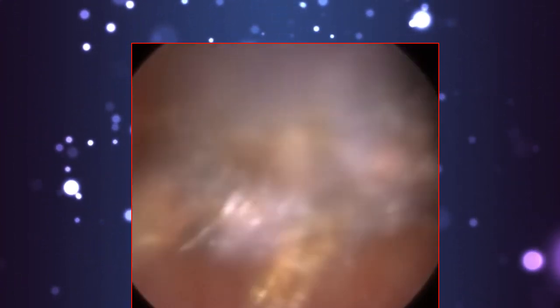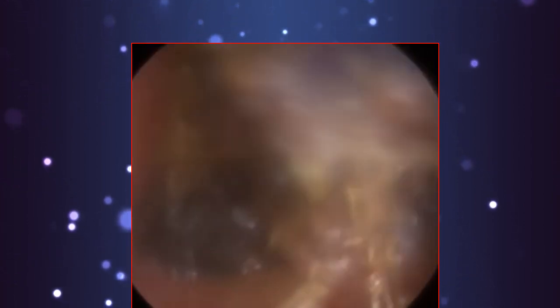When the eardrum gets sucked in, it can start eroding the bone, and worst case scenario, it can start eroding the ossicles, the three middle ear bones. But in this case, the ossicles are still intact: the hammer, what we call the malleus, the anvil, what we call the incus, and the stirrup, what we call the stapes. They appear to all be intact. We can only see the hammer bone, but the eardrum, because it had been sucked in against the top part of the ear canal, has restricted the blood flow to that part of the bone, and that bone has begun to erode.